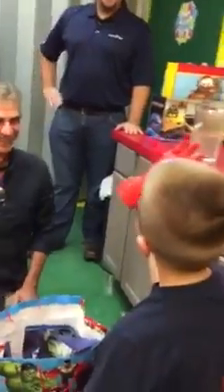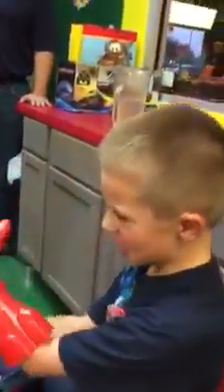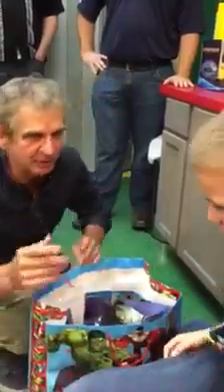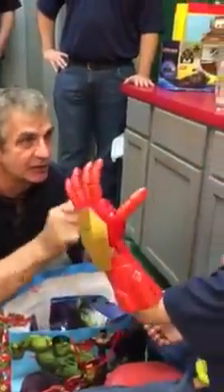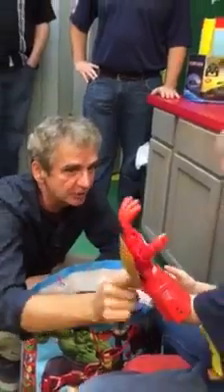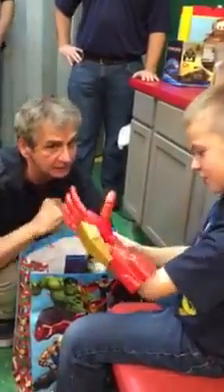It has colorful lights. Bend it. Can you bend the hand? Put it on and bend it. Can you bend it? All right. You've got a little. You're okay. You're all right. You've got it. We're going to pad it up for you, and then we can adjust all of this.